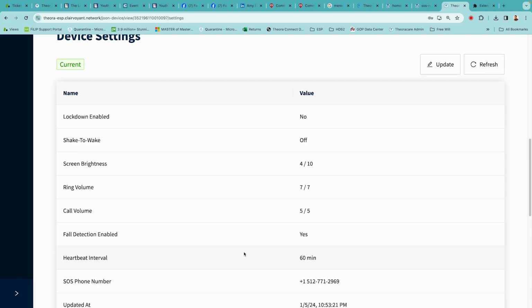This is more than just a sudden impact. Especially for geriatric patients, they do not just fall and suddenly catch themselves. So we're looking at a lot of things, much more than just G-forces. So we're monitoring this person for these anomalies.